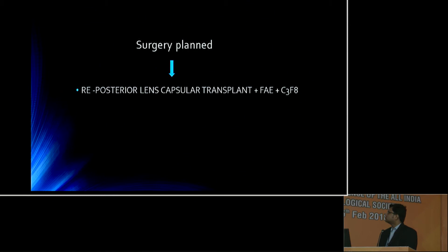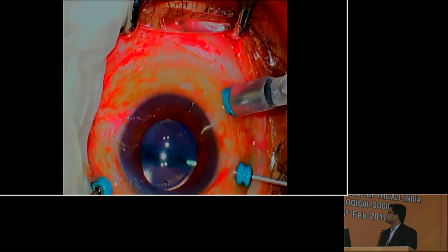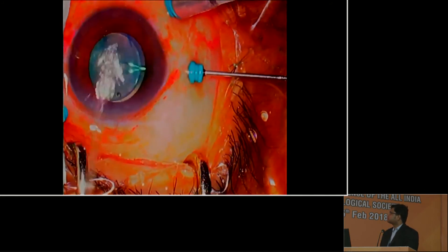Then we planned for the posterior lens capsular transplantation into the macular hole with C3F8. After making the ports, 1:20 indocyanine green dye is used to stain the posterior capsule. Micro forceps is used to perform the posterior capsular excision. The capsule is trimmed to a size bigger than the macular hole. The infusion is turned off temporarily so that the jet stream does not displace the flap. The flap is introduced into the vitreous cavity and gently released, then positioned in place using the diathermy probe. We see the proper positioning of the flap in the macular hole area.